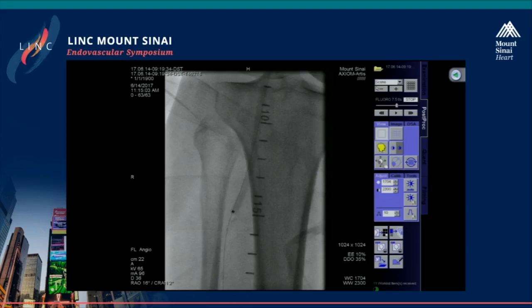I can propose that you show us the final result after a few talks. So absolutely, Dr. Bimini. What we're going to do is go ahead, DCB this, take good pictures of the tibials, fix the SFA, and we'll show you the final results, sir. Yeah, thank you. Thank you. Good case, guys.